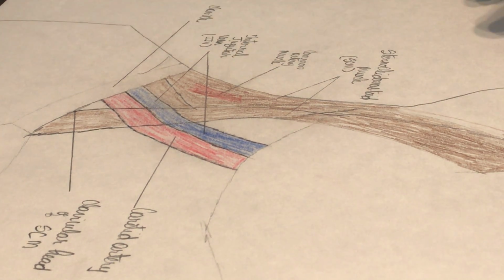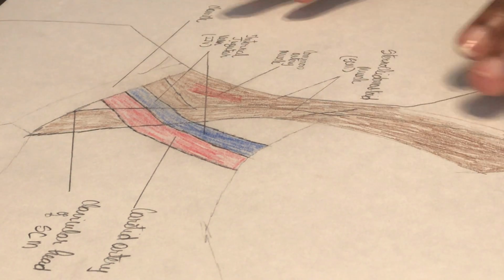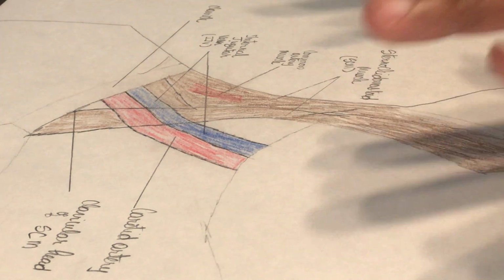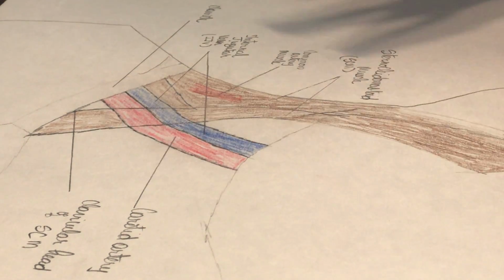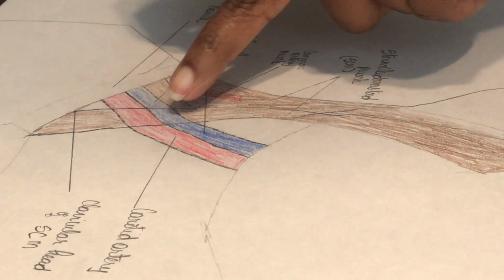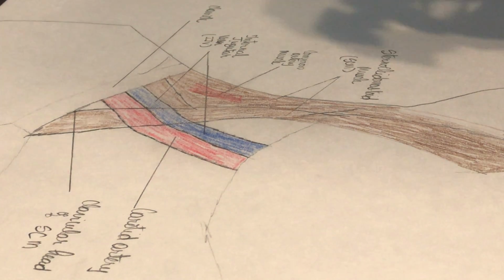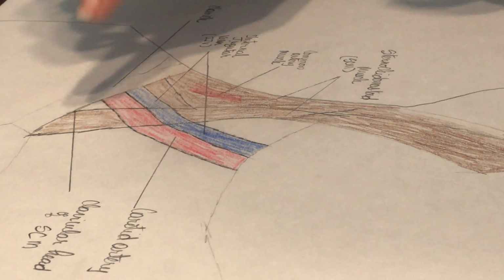This is a sterile procedure, but an ultrasound guided procedure as well. But before we lay down our sterile field, we're going to use the ultrasound machine to locate our site, our vessel. We're going to assess the vessel just to make sure that the vessel is not stenosed, there's no thrombus there, and that the vessel is very compressible.